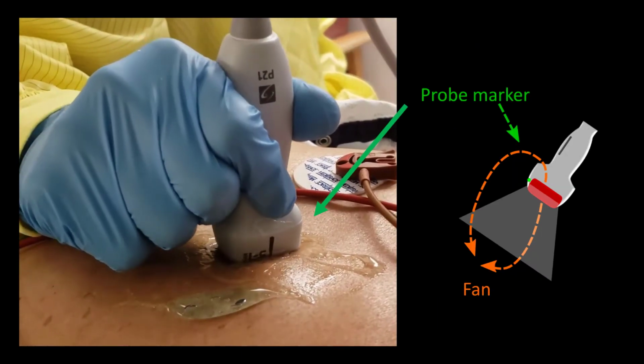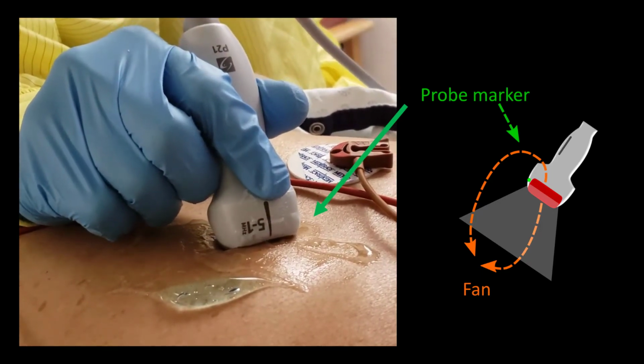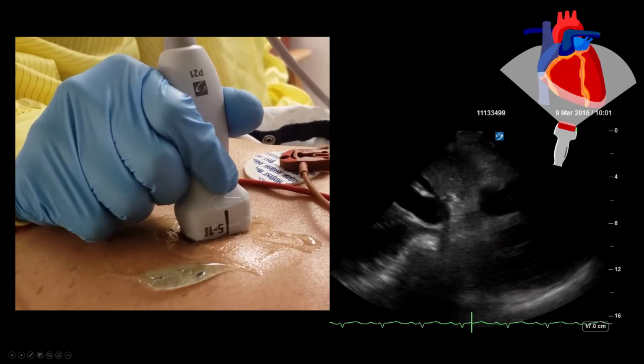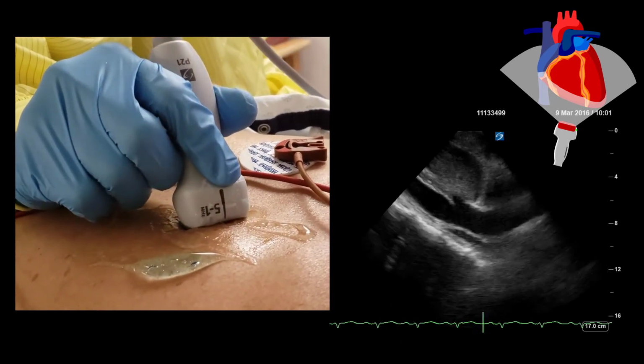To fan is the opposite movement of rocking. Again, we are lifting the side of the probe slightly while keeping contact with the patient. This is done perpendicular to the probe marker. The fan allows us to bring structures that are not on the same plane as the ultrasound beam into view.